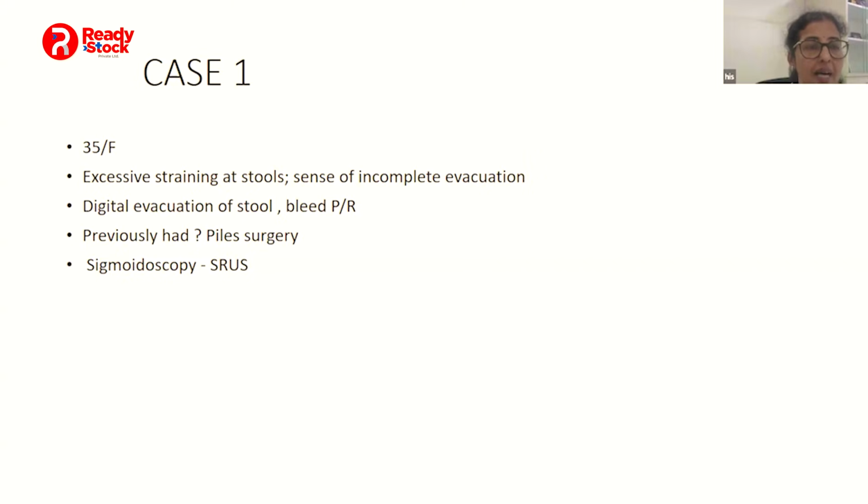So it as such rules out dyssynergy. So rectoanal coordination is present. Yes, yes. That is assessed by the balloon expulsion. Okay. Well, okay, thank you.